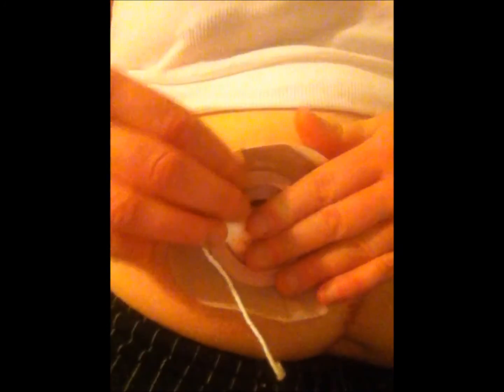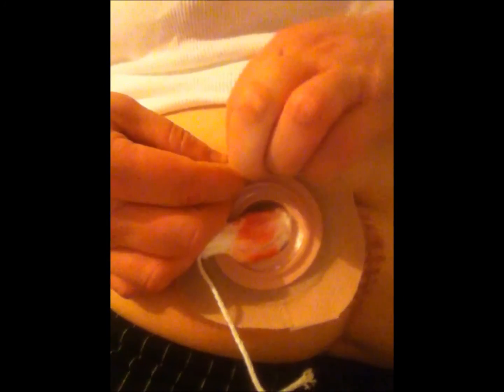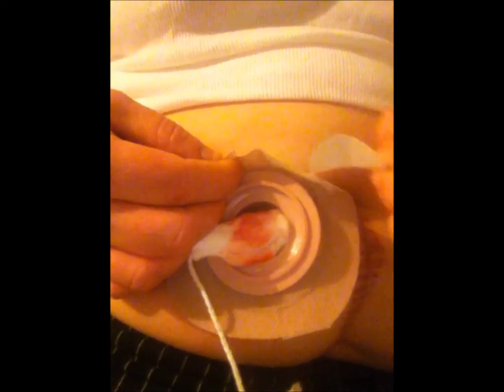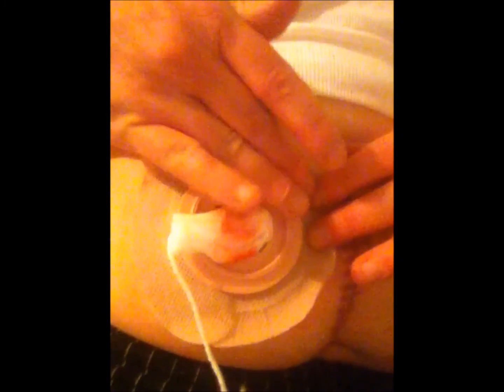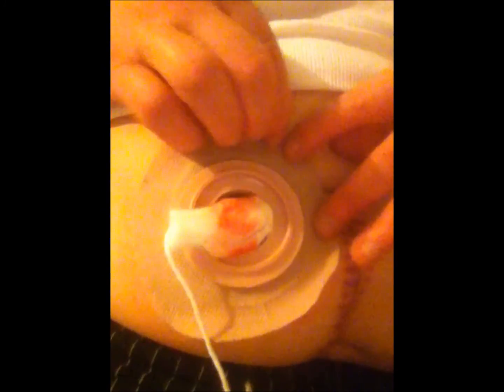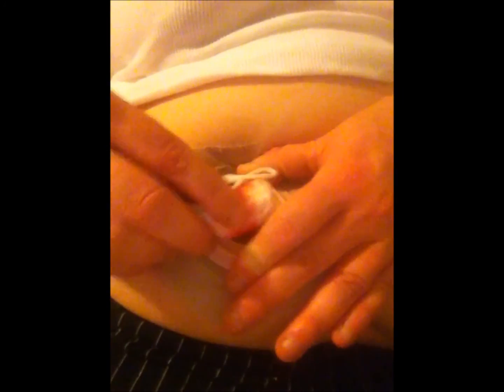So once I've done that, then I take the pieces that I pulled, and I take that off, and just like a band-aid, that's going to stick to me. So I've taken off both sides. Now I'm going to just glue it onto my body like a band-aid, and it's nothing more than a band-aid. And now that is my appliance. I hate that they call it an appliance, but that's an appliance.